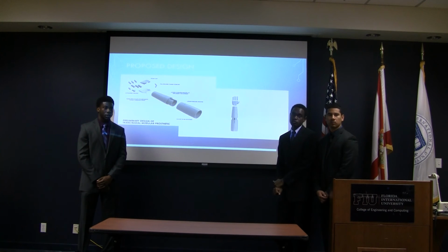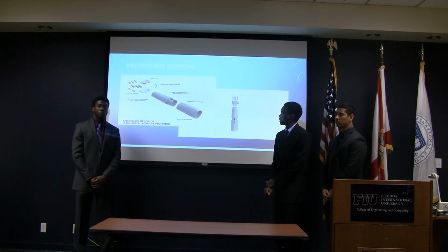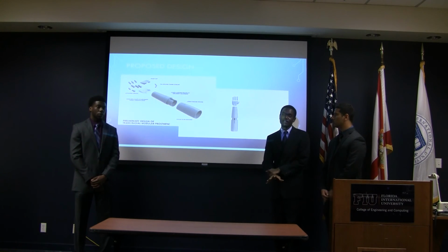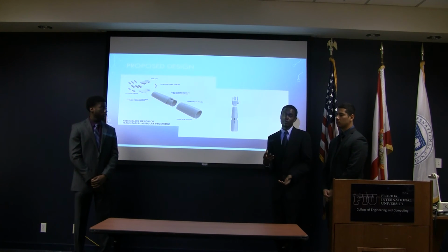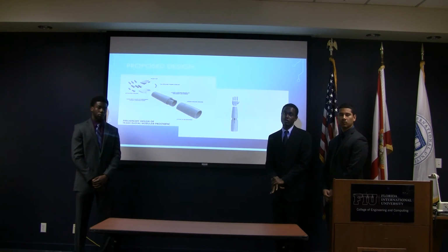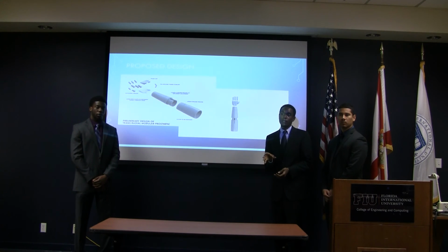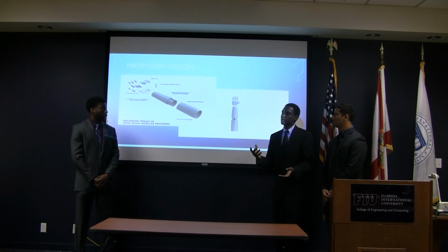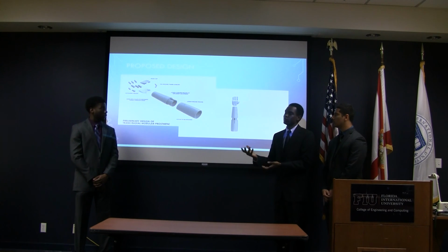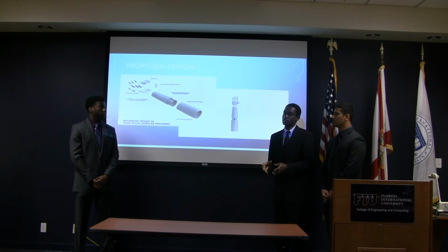Now, do you have any idea how much it would cost to produce that? Well, we want to try to find the cheapest and most reasonable means of producing the prosthetic. 3D printing, as of right now, seems like a good way to go, but it depends on how feasible a 3D printed prosthetic is as far as being able to take loads. That's one challenge that we're seeing.